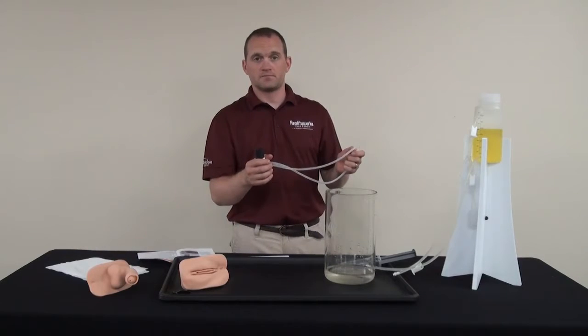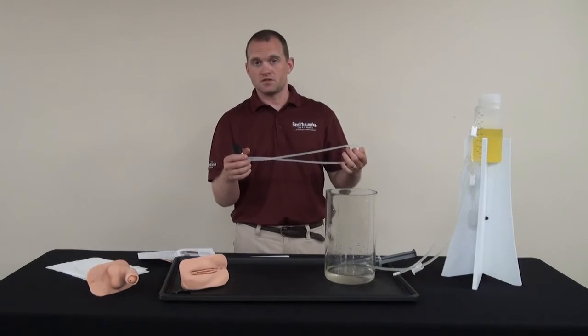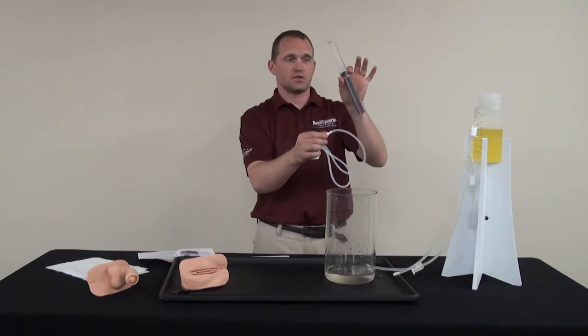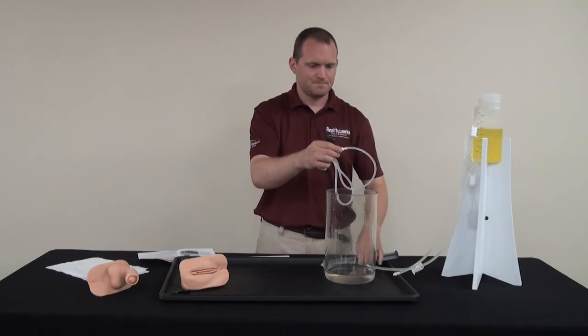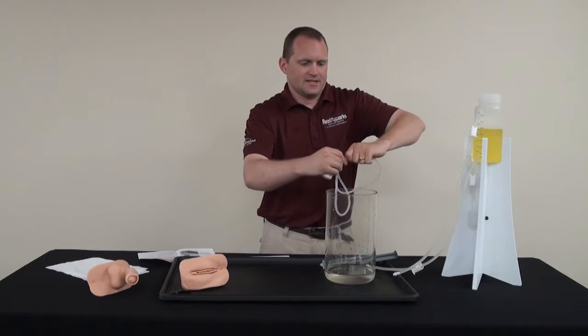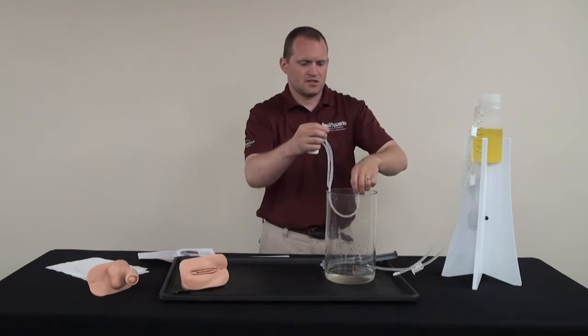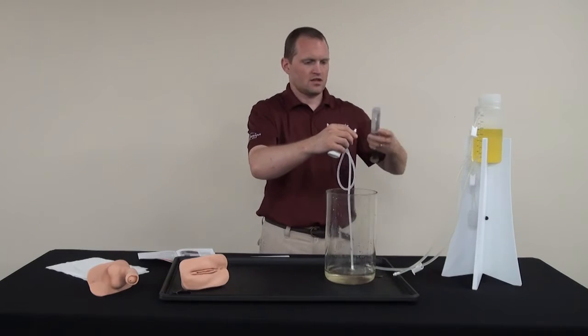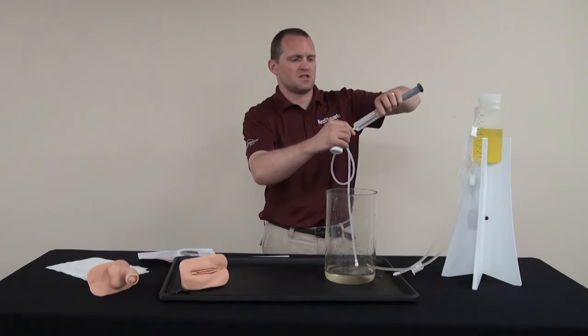So to clean out the bladder, it is best to do this above a sink. Take the syringe, fill it with water, connect the syringe to your hose.